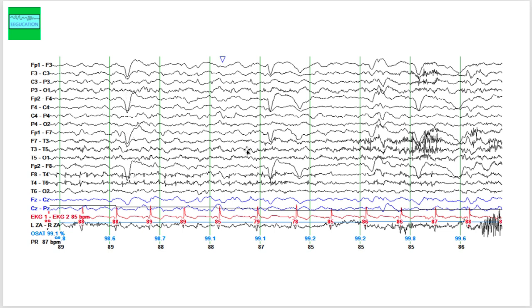We see eye blink artifacts and a slow background. Looking at this page, you can appreciate delta frequencies and theta frequencies, as well as some faster frequencies. This is a delta frequency, and on top of the delta frequency you also see theta frequencies and alpha frequencies. These are beta frequencies riding on top of the delta frequency.